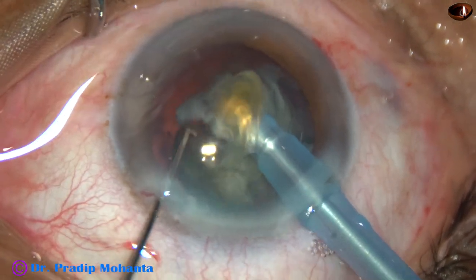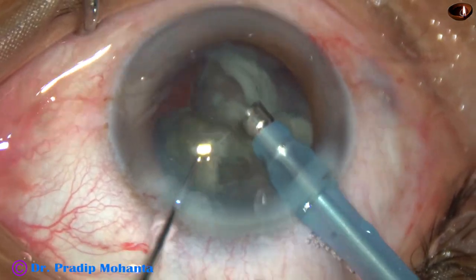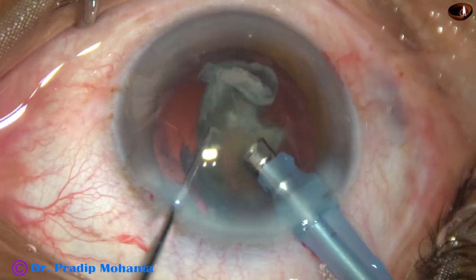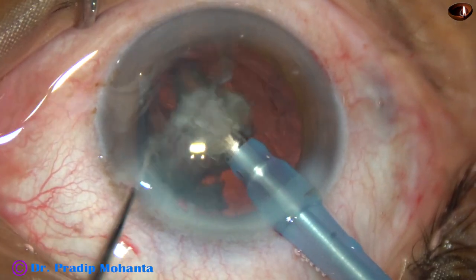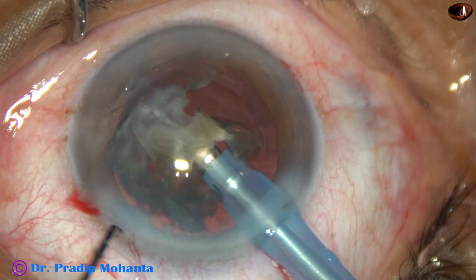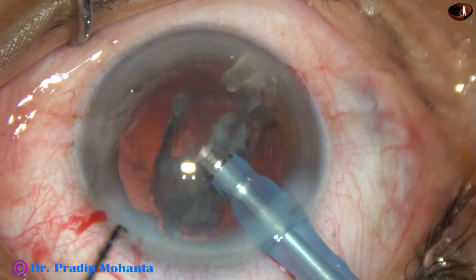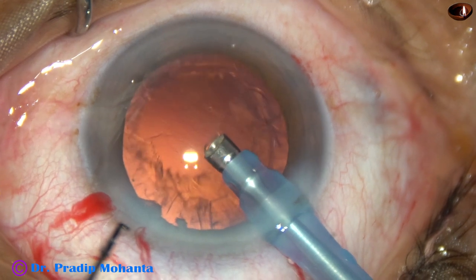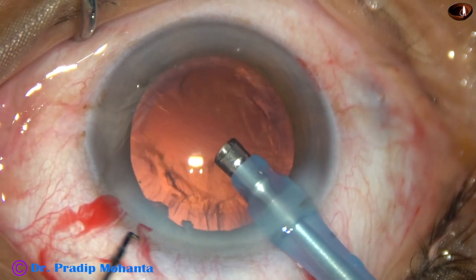Now each large fragment is emulsified with ultrasonic energy and removed. In this case, we are in high vacuum from the very beginning. Vacuum is 450 mmHg, flow rate is 45 ml per minute, and ultrasonic energy used is 60%. This is the last nuclear bead. At this time, the chopper has been removed for better stability of the anterior chamber.